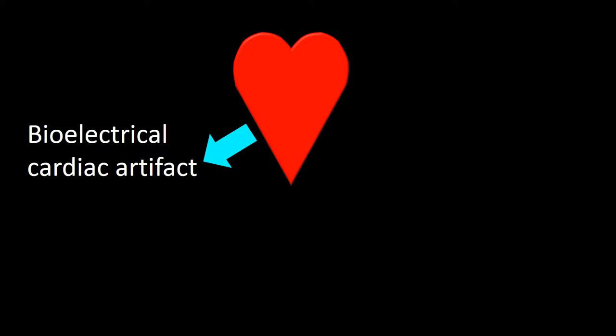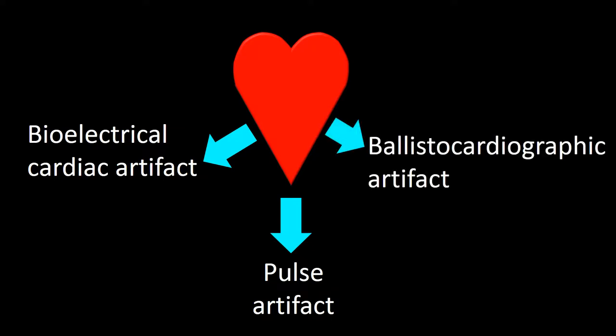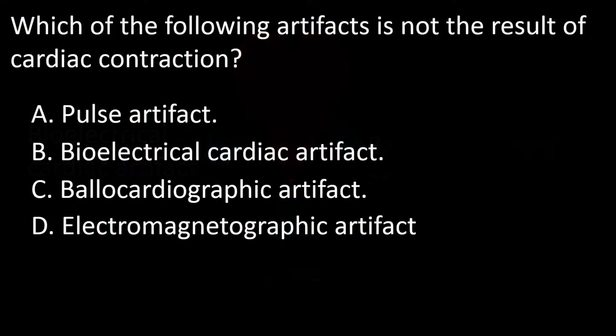The heart produces bioelectrical cardiac artifacts, pulse artifacts, and ballistocardiographic artifacts. So the answer to this question is D.